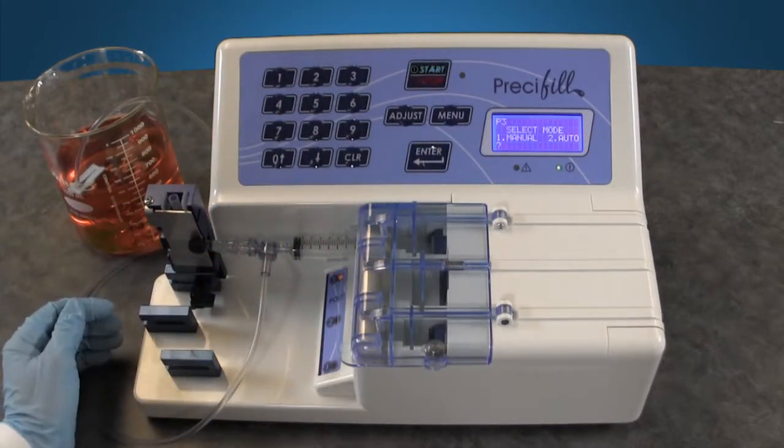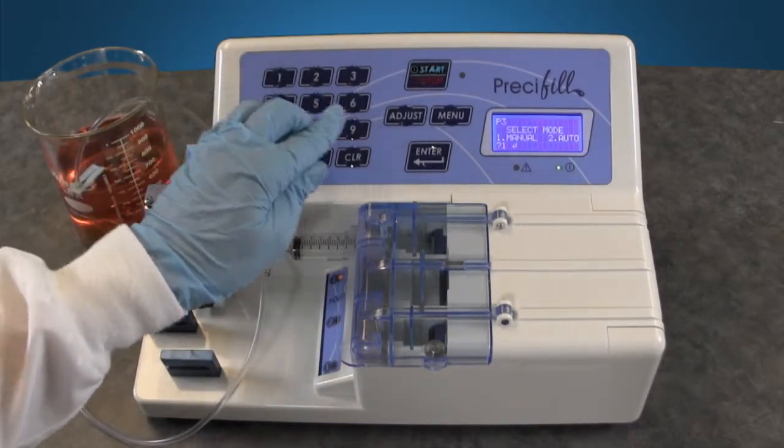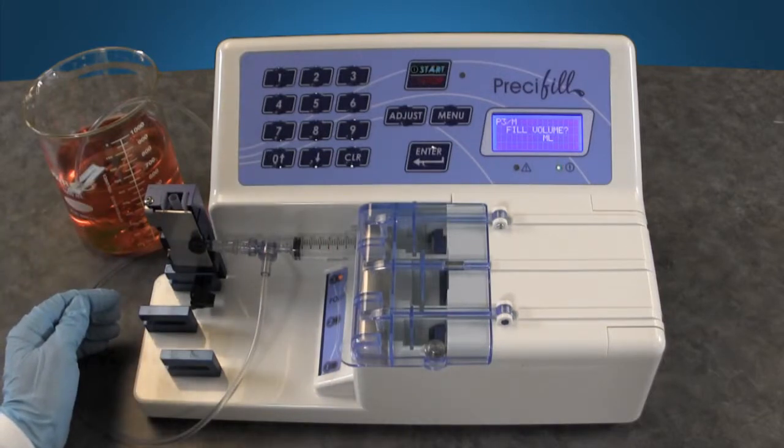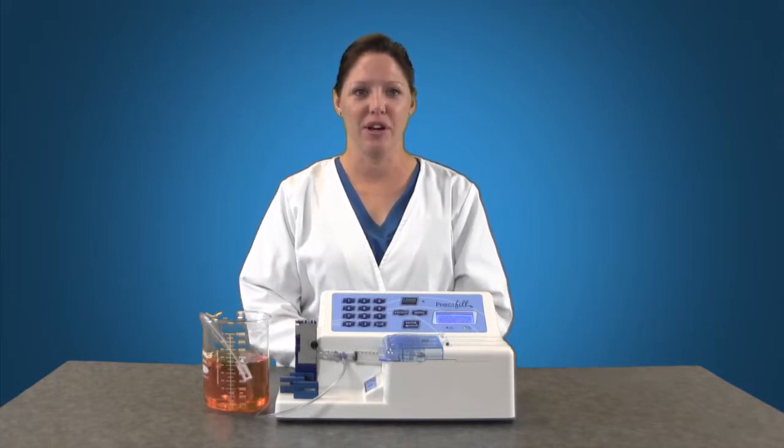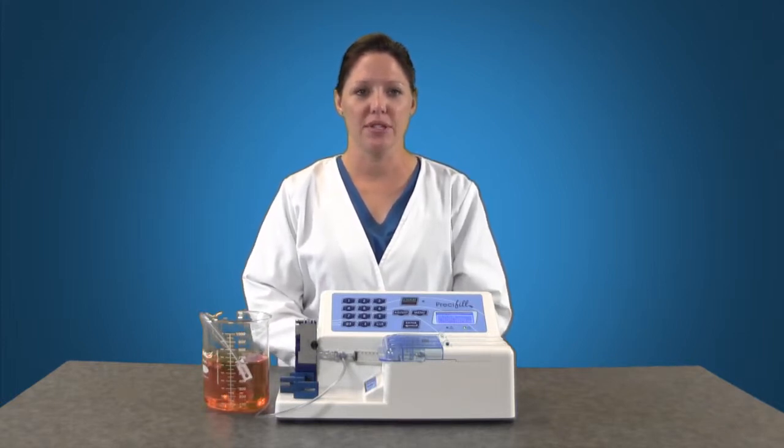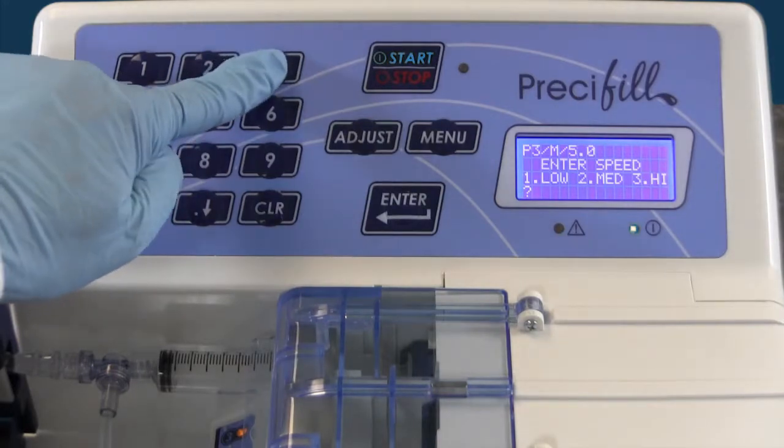You now have an option to choose the fill mode, manual or automatic. We will start with manual and explain the automatic process shortly. Press 1 and enter for manual. Enter your fill volume, in this case 5 mils and enter. You need to select your speed. 1 for low, 2 for medium and 3 for high. On average you will use 2 for medium speed. Liquids that are very viscous or generate a lot of bubbles may need to be used on a low speed. Liquids that are more watery and don't generate bubbles can run on high. The smaller the fill volume, the lower the speed to ensure accuracy. We will demonstrate high speed initially. Press 3 and enter.